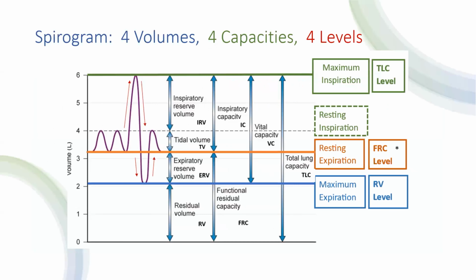The heart and soul of spirometry, of course, is the spirogram. Spiro is the combining form referring to respiration. A spirograph or a spirogram is the tracing of the ebb and flow of respiration in and out of the body. Respiratory therapists are very accustomed to tidal volumes that we talk about with mechanical ventilation. This is basically the same thing.